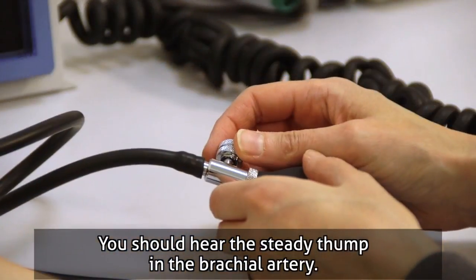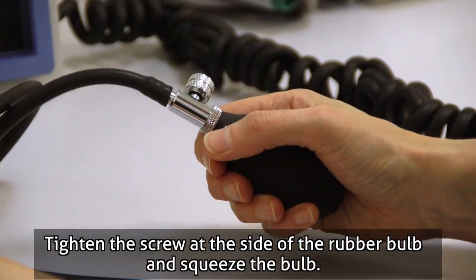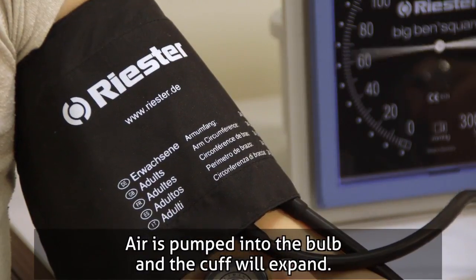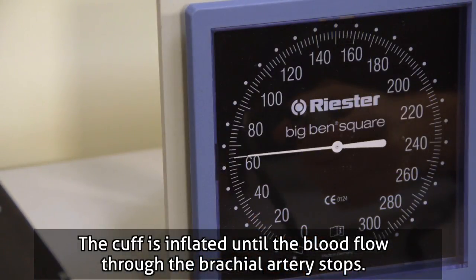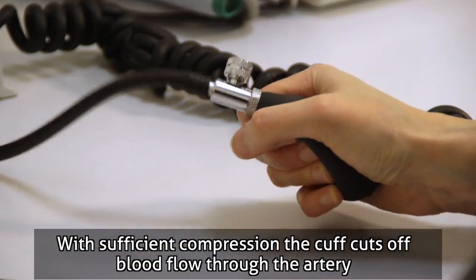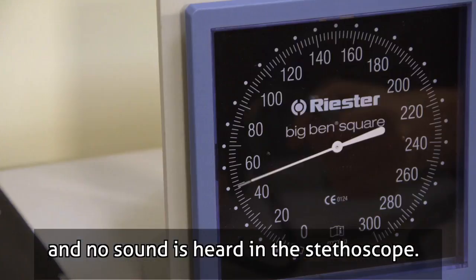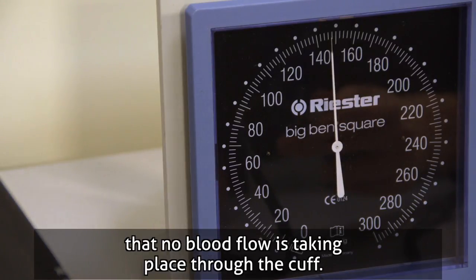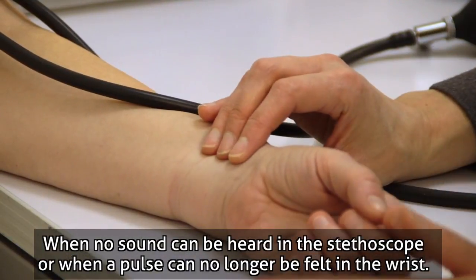You should hear a steady thump in the brachial artery. Tighten the screw at the side of the rubber bulb and squeeze the bulb — air is pumped in and the cuff will expand. The cuff is inflated until the blood flow through the brachial artery stops. With sufficient compression, no sound is heard in the stethoscope. The pressure in the cuff is increased rapidly to 30 millimetres of mercury above the point where no blood flow is taking place, when no sound can be heard in the stethoscope or when a pulse can no longer be felt in the wrist.